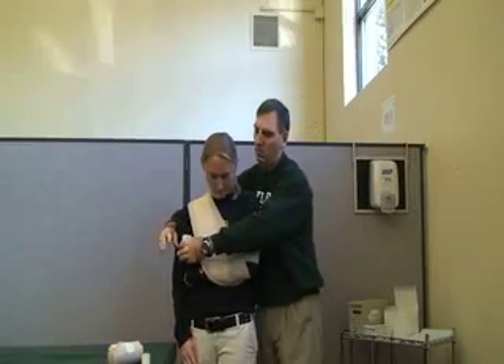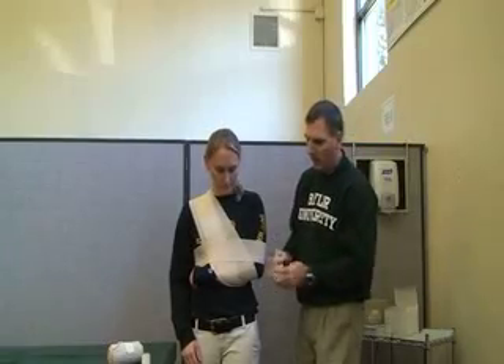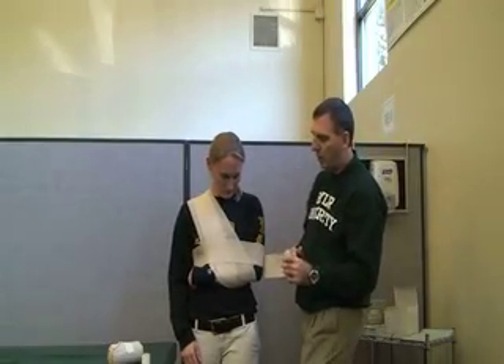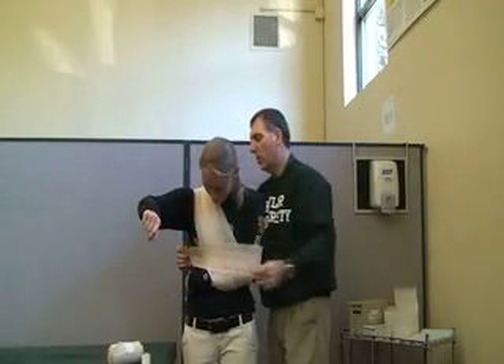Just above the elbow and around the waist. You can do this one or two times — one should be enough, depending on how much wrap you have left.